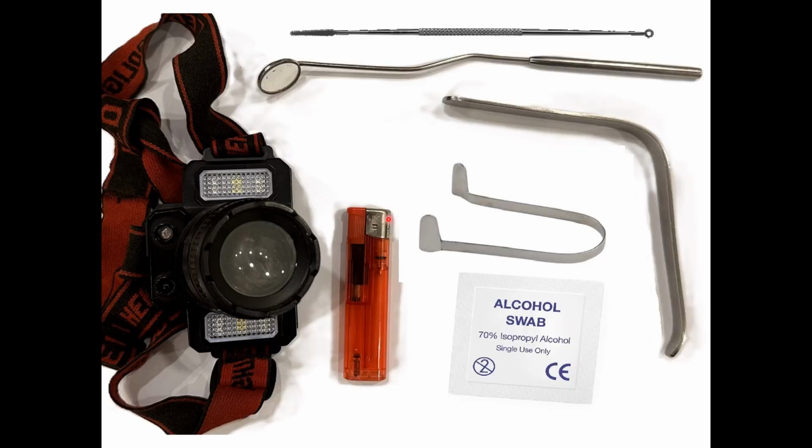So these are the basic equipment which is needed to perform the ENT examination. This is the headlight. This is the metallic spatula or tongue depressor for patency test and for posterior rhinoscopy. This is a posterior rhinoscopy mirror. This is the nasal speculum for anterior rhinoscopy. Alcohol swab is for the smell test. Better if you have scented handkerchief or scented cloth. Then this is the lighter to heat the mirror, and this is Jobson horn probe.